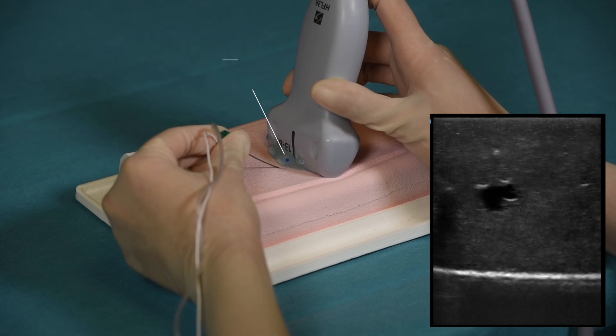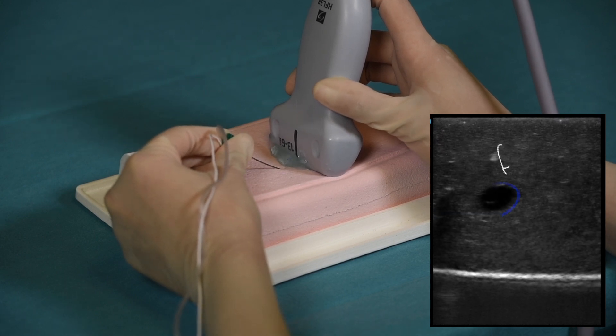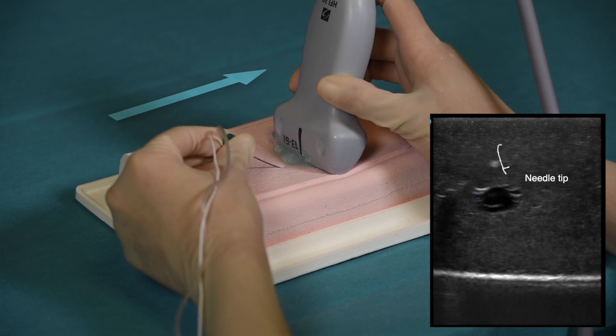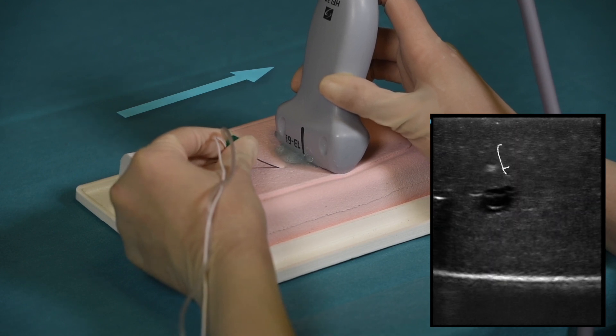Here we can see the needle tip approaching the blood vessel and the maneuver that consists of continuous slow advancements of the ultrasound probe in order to reach the blood vessel.